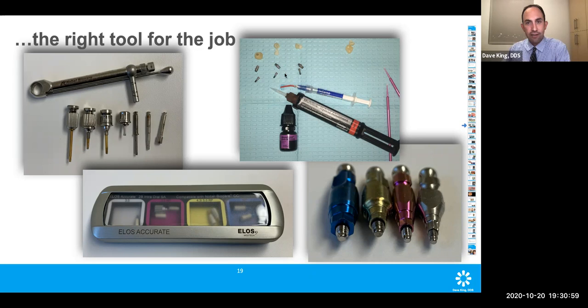These are titanium bases, tie bases. This is the process that we use to affix the tie base to the abutment and then to the crown in the mouth. So here we've got a screw retained crown that's going to attach to the tie base. Here we've got a cement retained crown that's going to attach to the custom abutment that's going to attach to the tie base. And then the same thing here.